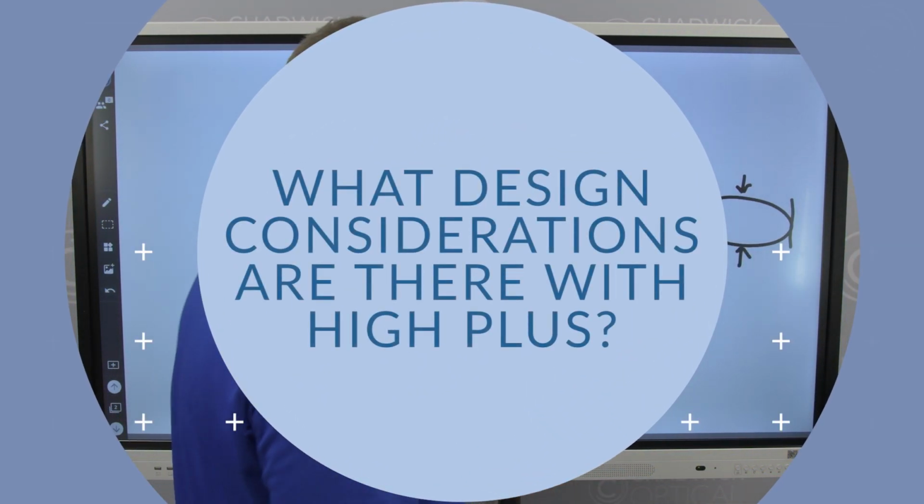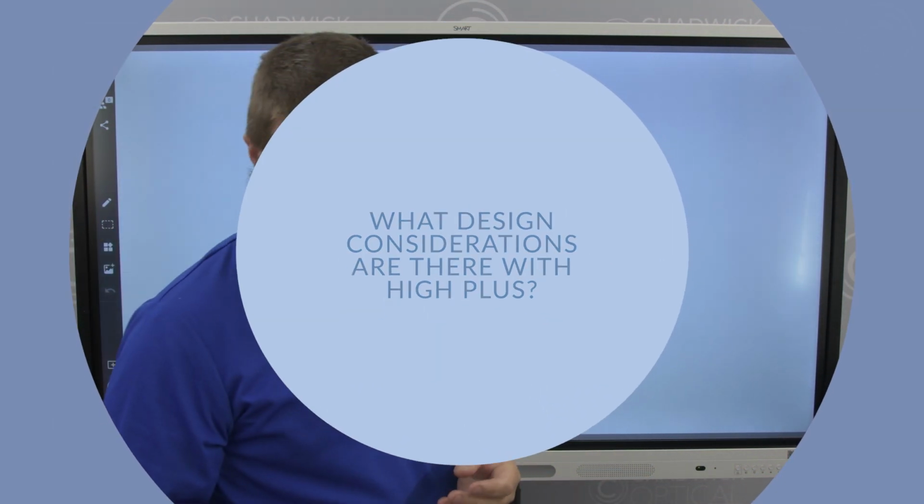What design considerations are there with high plus? There's a lot of different lenses available out there. When you're dealing with a high plus script, one of the more important considerations is asphericity.